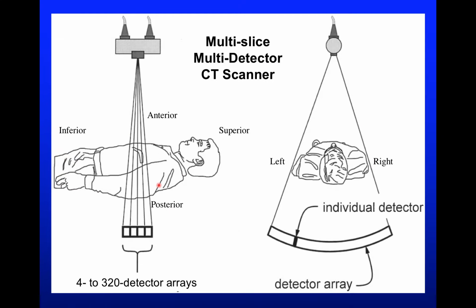Take note of these coordinate systems because they'll come up. When a patient is lying down like this and you look at the image, the coordinates that should be in your head are superior to inferior, so the top of their head to the tip of their feet, anterior to posterior. If we had a dorsal fin, it would be on our posterior side, right? We don't. And then left and right. Okay, and so that forms the 3 space. So when you're looking at data in 3D, usually what's labeled in the corners of the image or the sides of the image are these coordinates, right? Usually just the first letter.